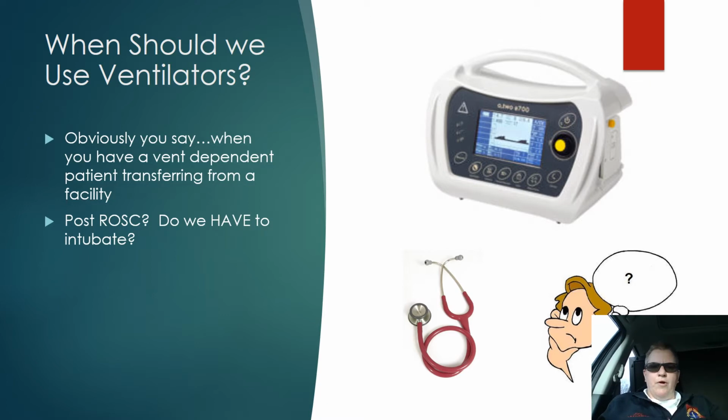It helps free up your hands. You've got a lot to do post-ROSC. You've got to do a 12 lead, get a good set of vitals, decide where you're going, start a couple lines, infusions afterwards, setting up your amiodarone drips and dropping an NG tube down, trying to figure out just how to support that patient so that they don't rearrest. So why not free up your hands?